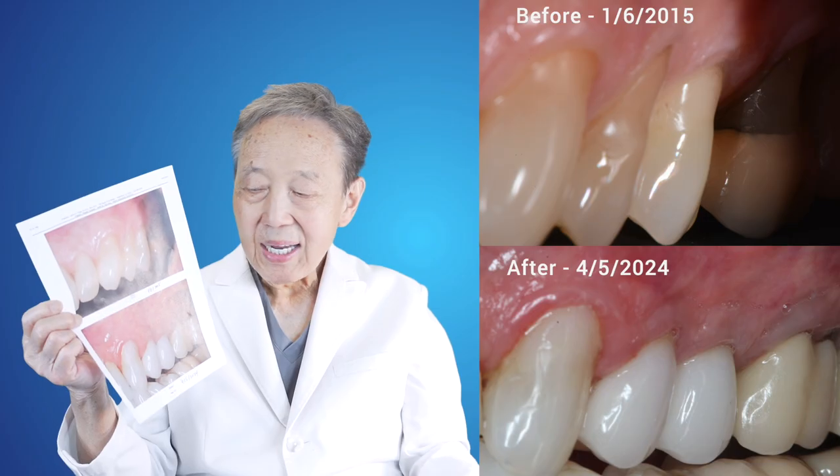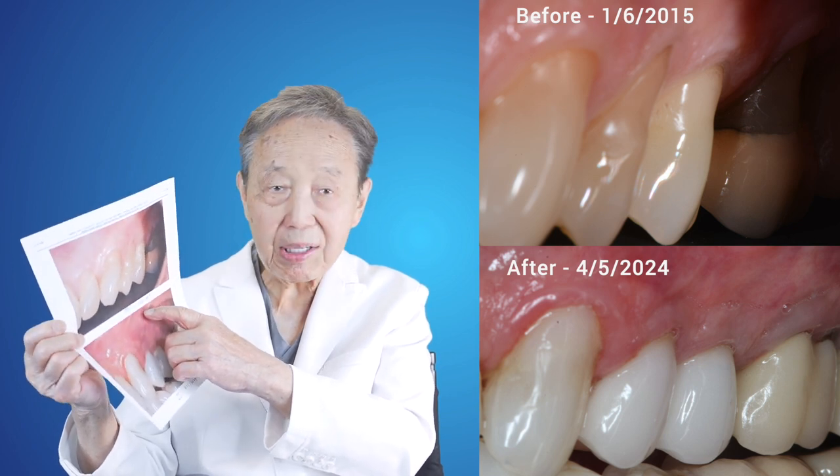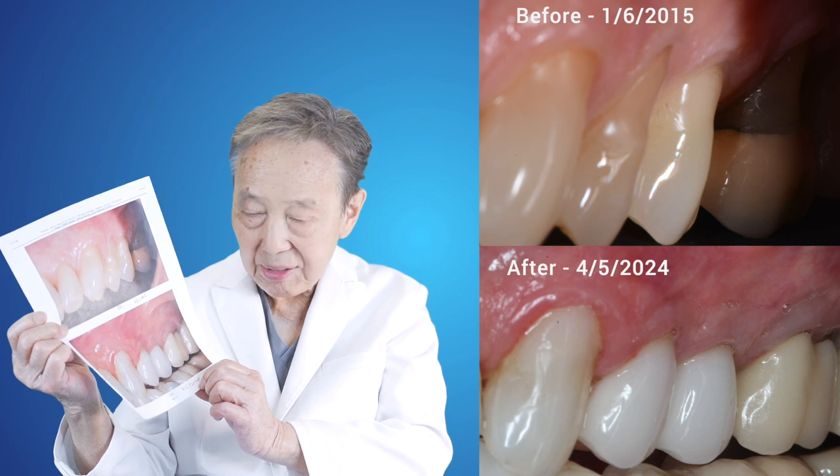This is Dr. John Chow. I want to share with you a nine-year case. I did this case back on January 6, 2015. Now this is April 15, 2024.